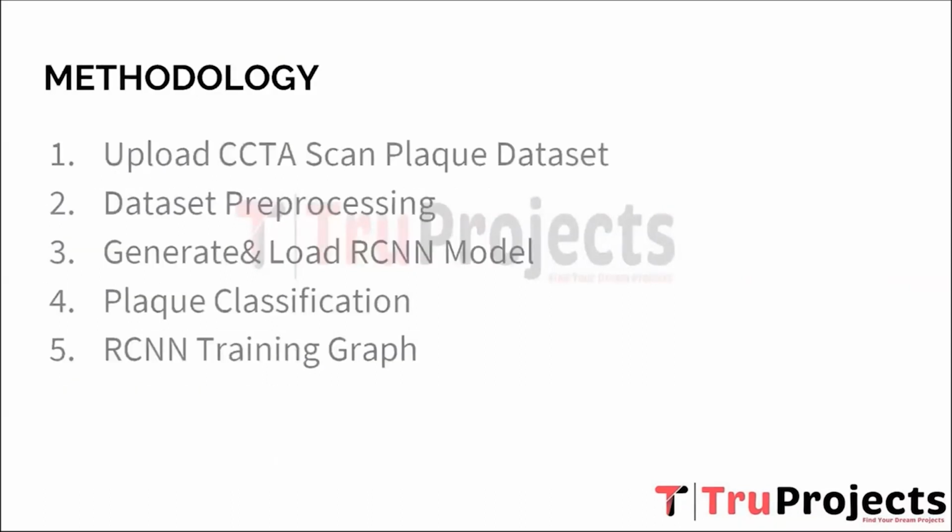Now coming to the methodology part, first we have upload CCTA scan plaque dataset. The first step in this process is to upload the CCTA scan plaque dataset. This dataset contains a collection of coronary CT angiography, that is CCTA, images that have been annotated with information about the presence of coronary artery plaque. The dataset is essential for training and evaluating the performance of the RCNN model for plaque classification.